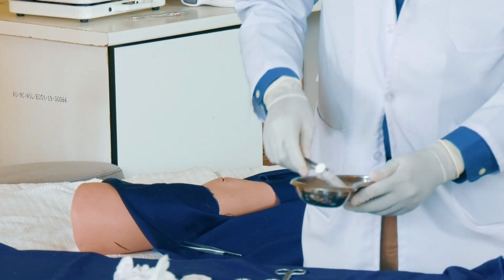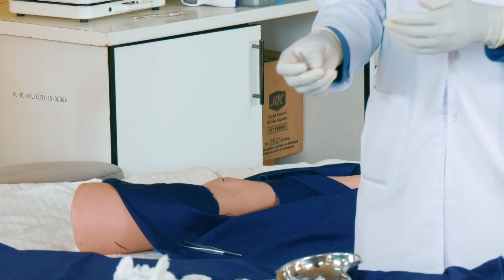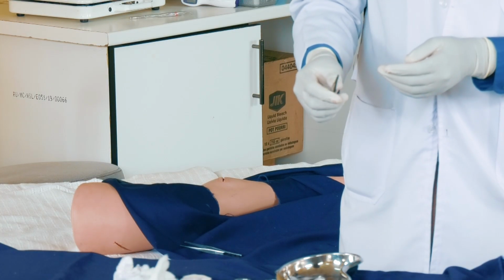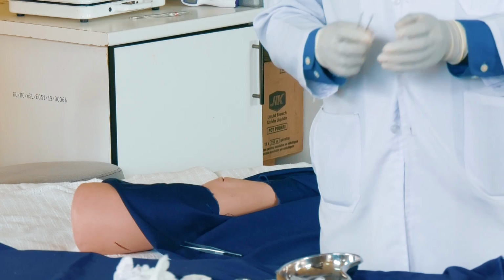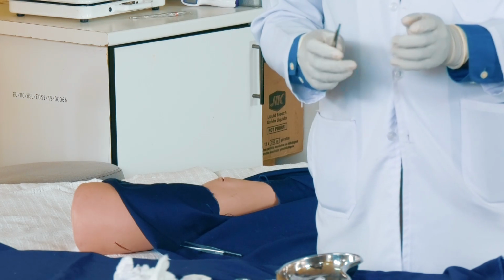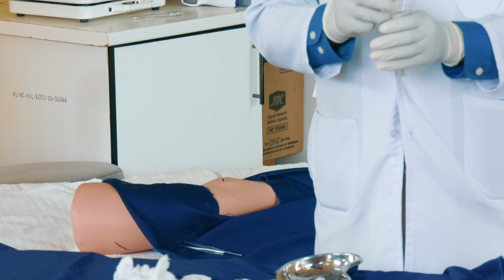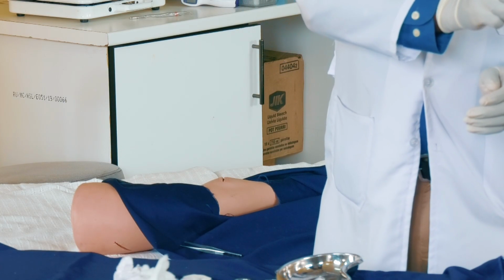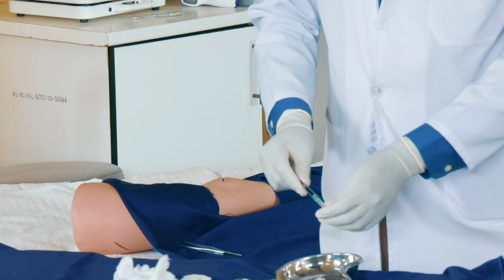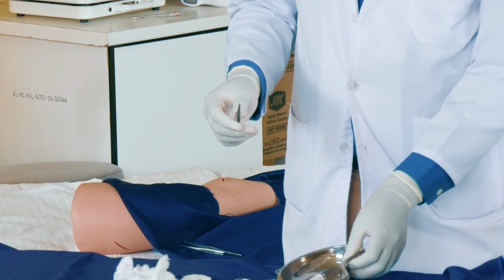So, needle. Let's move quickly. How many minutes are we like? So open the same way. Even these things that she's giving me, we are rushing so that we go within the 25 minutes. You check the expiry date, everything that you are getting. Another one, another needle. We'll get the reason for this.